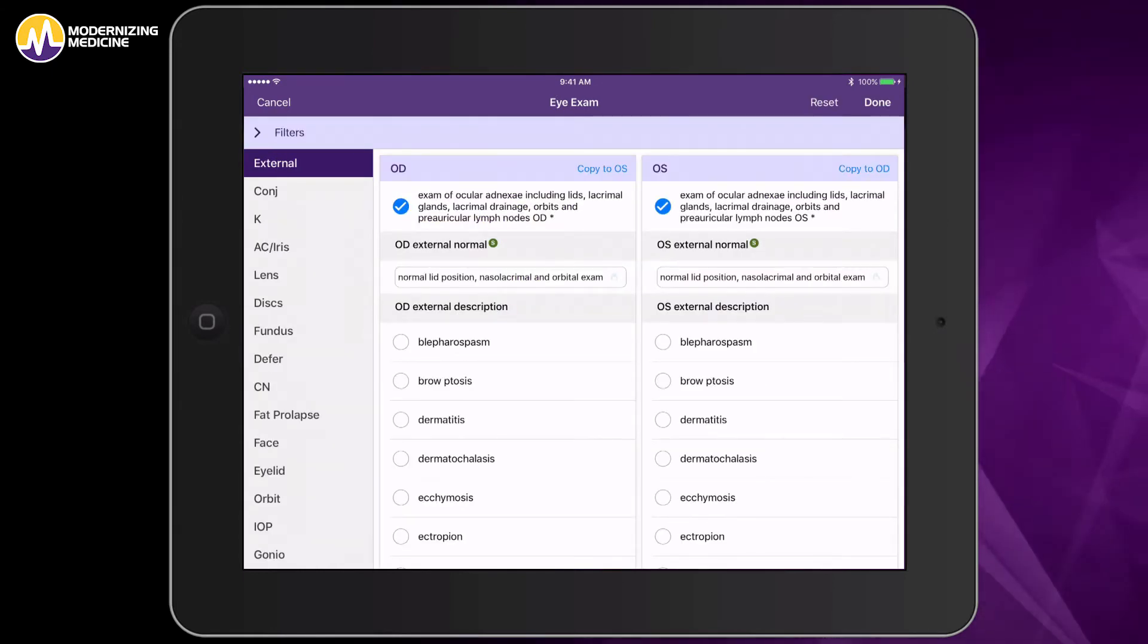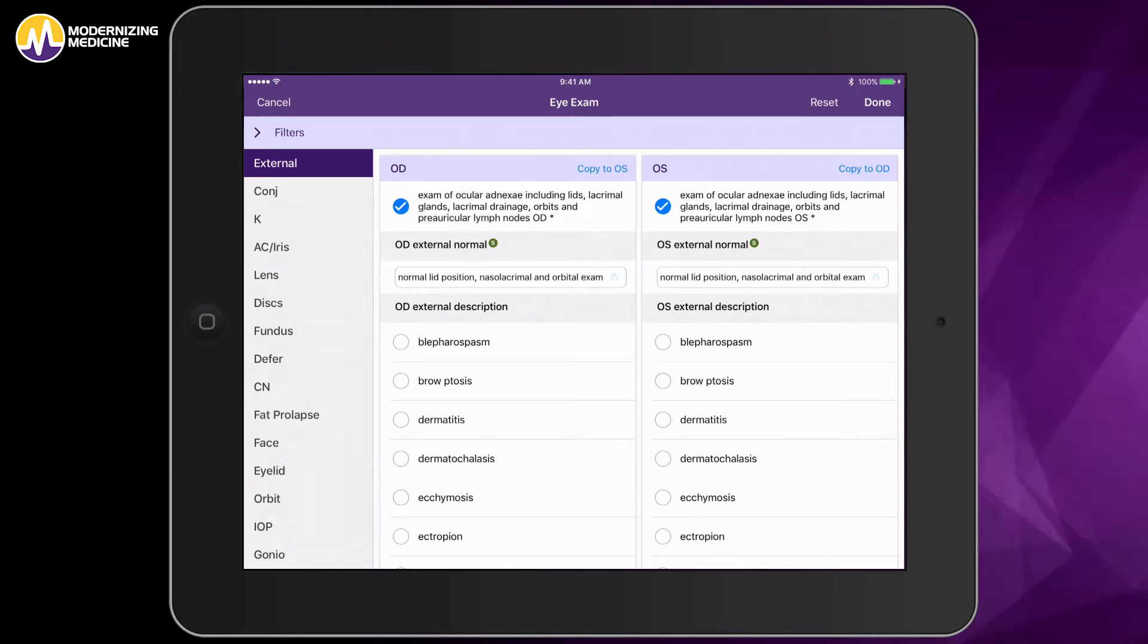This is what your exam will look like. You can document your findings in the areas down below.